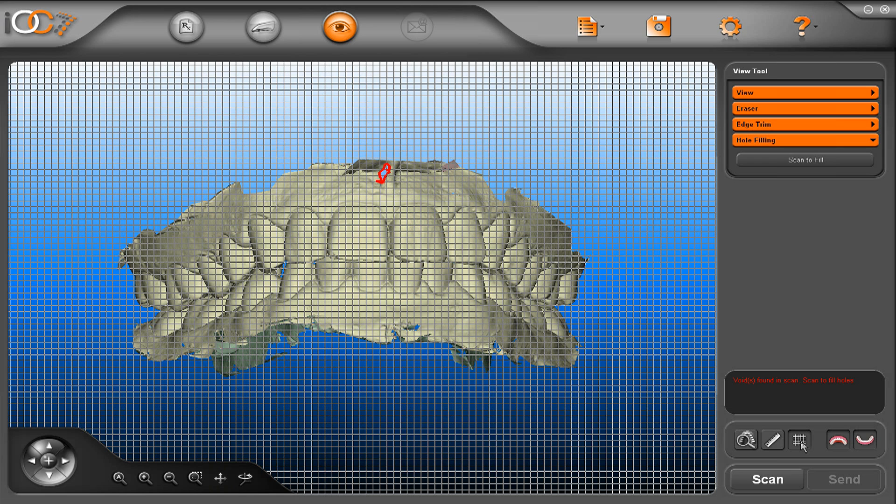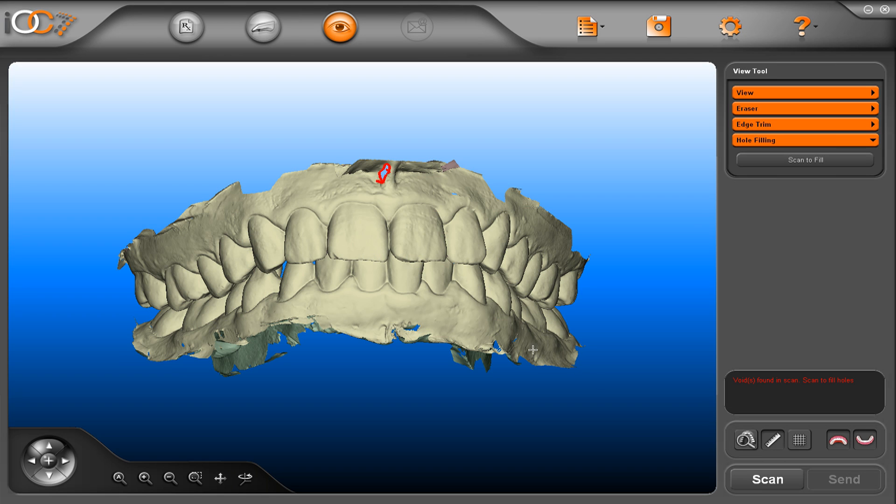You can use the grid option, and you can measure the model from one point to another.